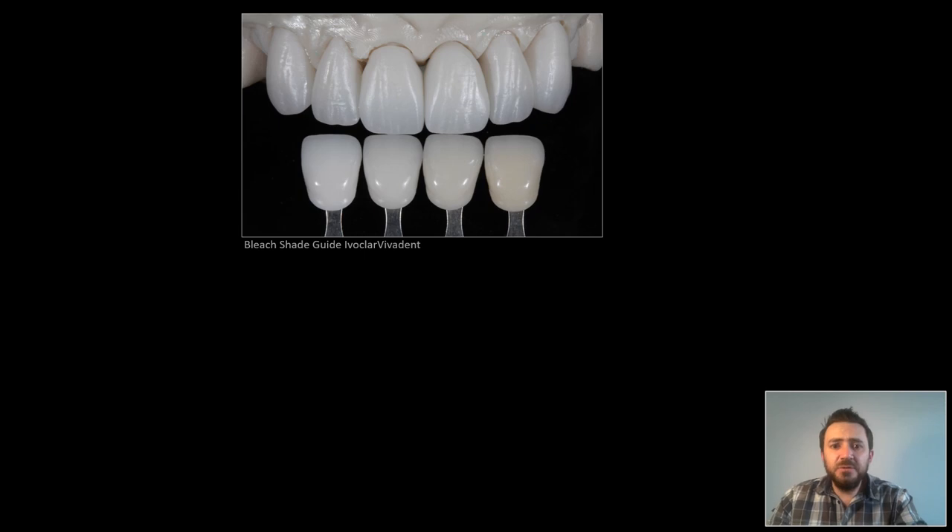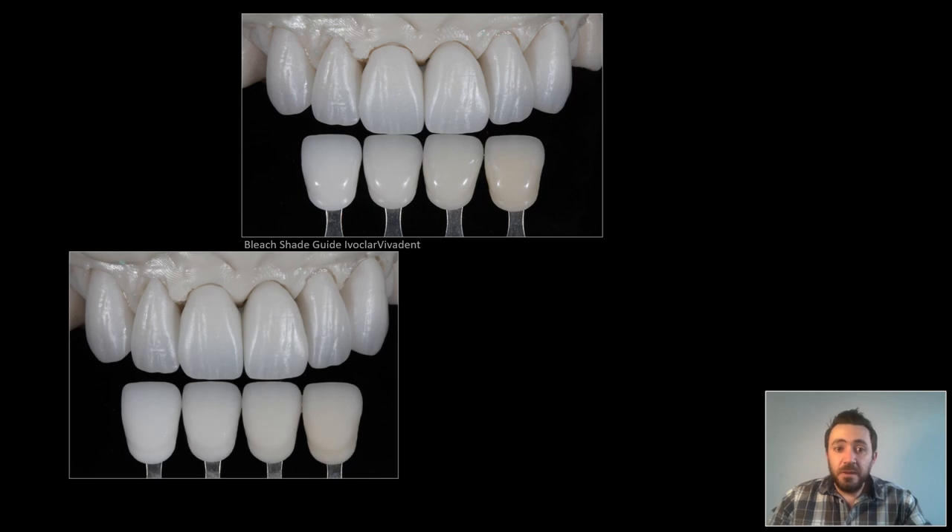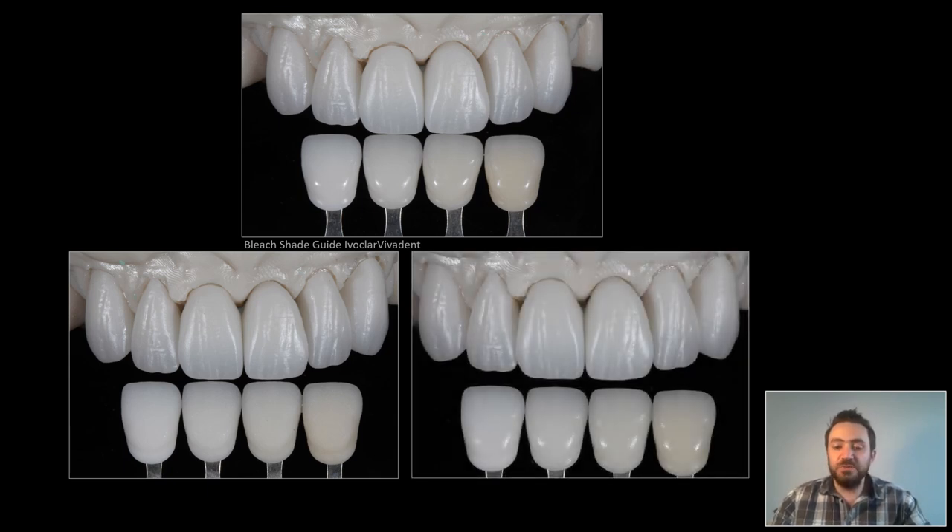Then I do a final shade check before moving to the staining step. As you see here, it's very difficult to observe any shade match when the two samples you're comparing have different surface light behavior — a shiny shade guide versus matte crowns. So what I do here: I sandblasted my shade guide and moistened both the shade guide and the crowns equally with glaze icon. Then I can clearly see the accurate shade match in all color dimensions because they both now have the same surface light properties. See here the beautiful and very accurate shade match of the Prime Bleach 2.